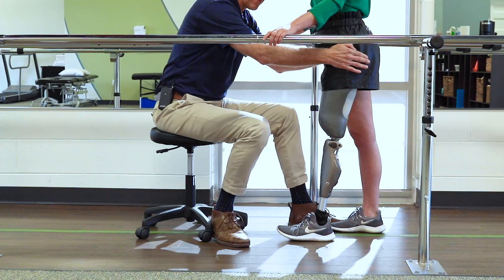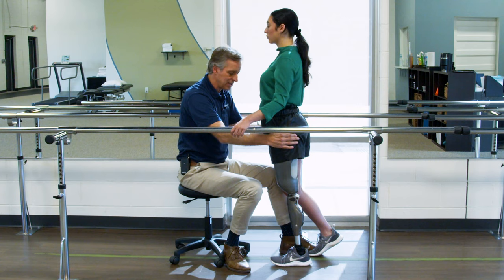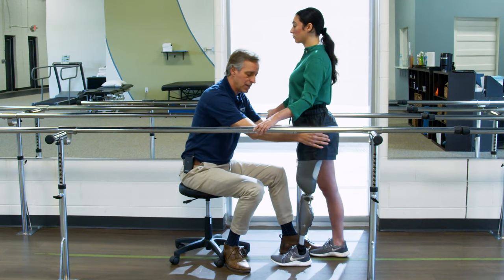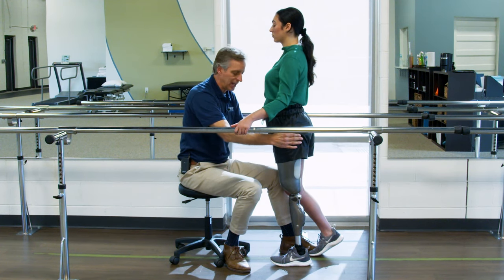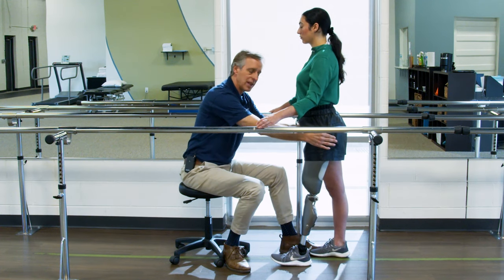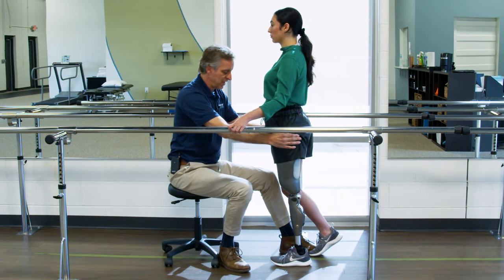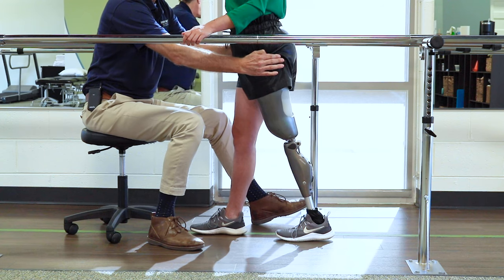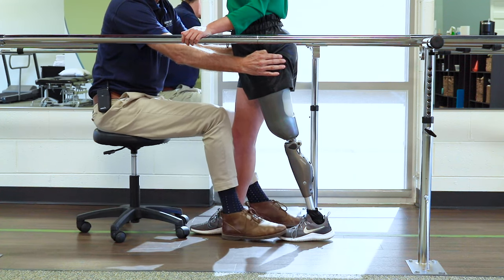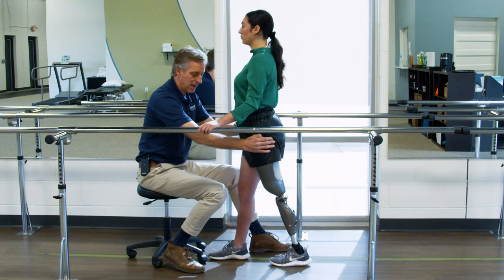All we're doing — and this can take time — is repeating this process over and over. Someone could be standing at their kitchen sink or using a walker, using lots of different mechanisms to go through this process of initial contact into mid-stance. True mid-stance means your other leg is relaxed, your hands are on for support but you're letting that leg relax and get ready to take a step. From that process we then want to finish stepping. Tracy, come forward, load that leg — pylon vertical — your other leg is totally relaxed, and then step through.